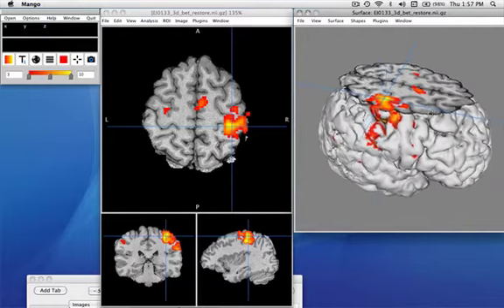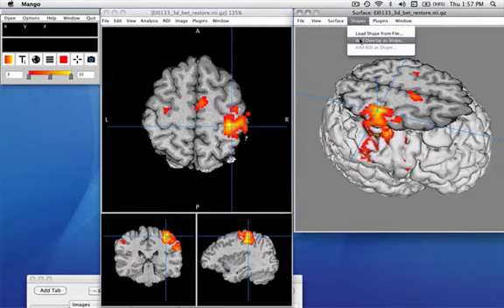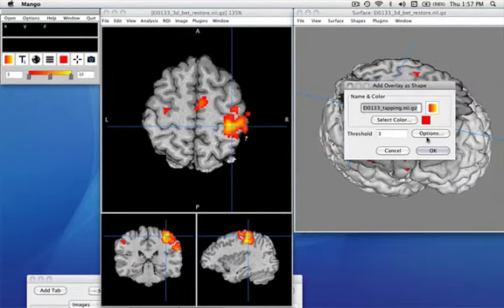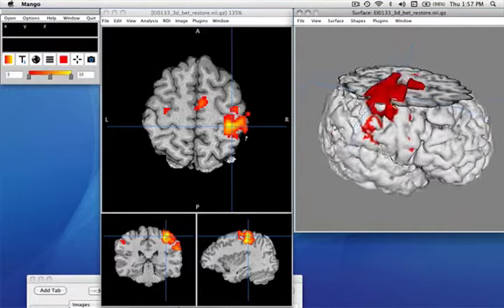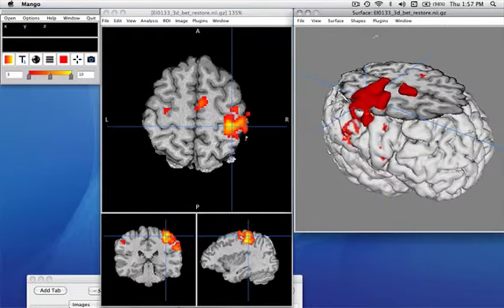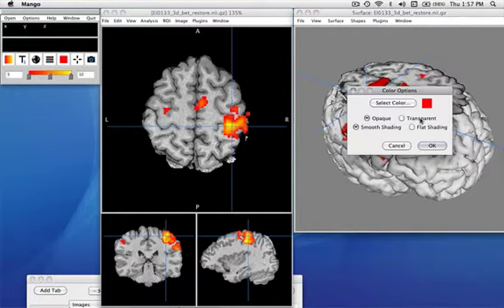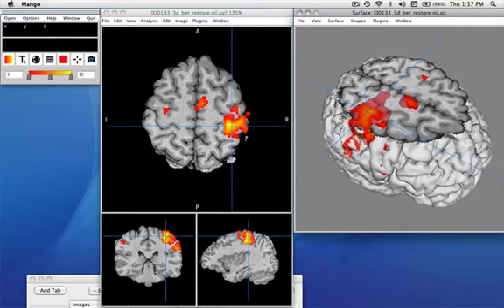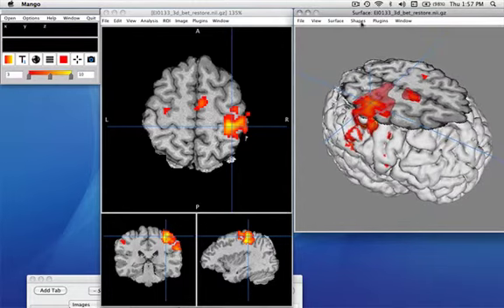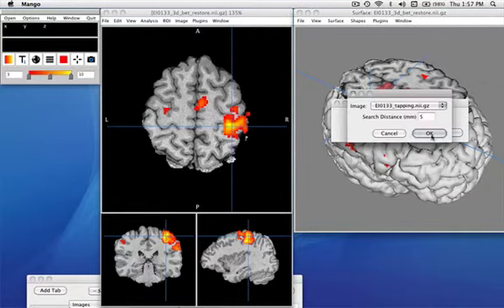Once we have a cut plane, we can see surfaces and slices at the same time, though the information is not particularly helpful in this format. I'm going to add one other feature: building a shape from the overlay. We'll take the same threshold to build a shape. Now you can see the shapes extending out in 3D space above the slice. I'll make it transparent so we can see the slices and surfaces through it, and then do the overlay onto it as well.